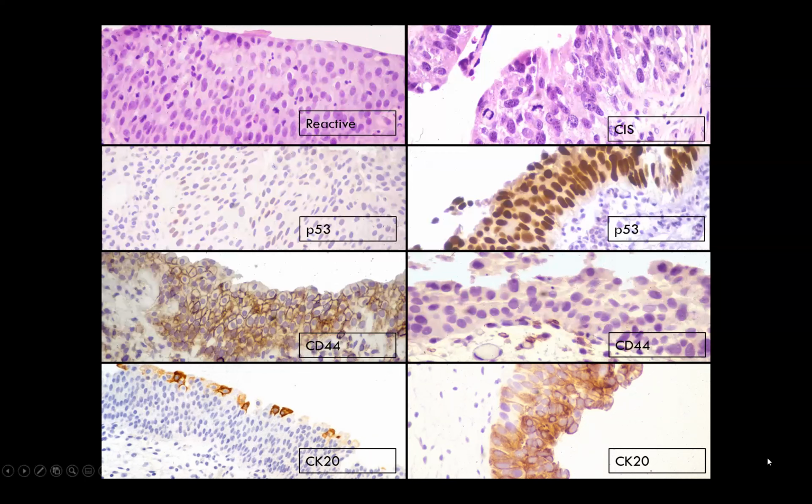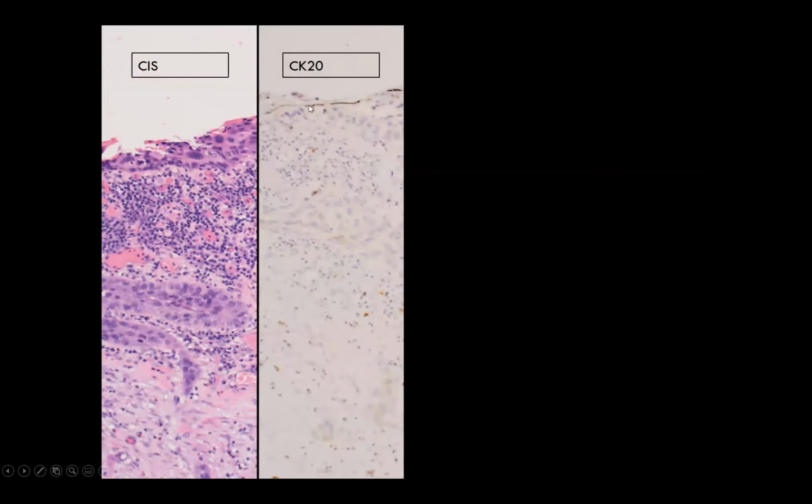Unfortunately, the answer is not that easy. So I will show you with a couple more examples. So here's another case of clear-cut carcinoma in situ with some extension into the Brunn's nest over here. And what happens when we apply these stains?